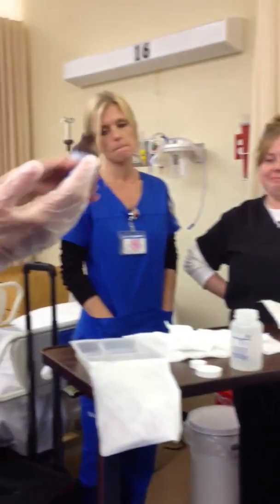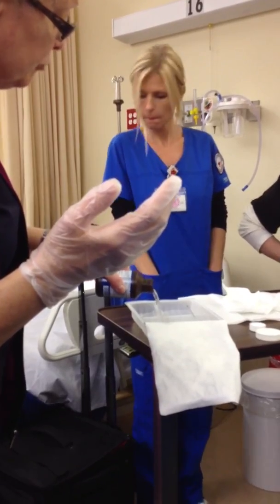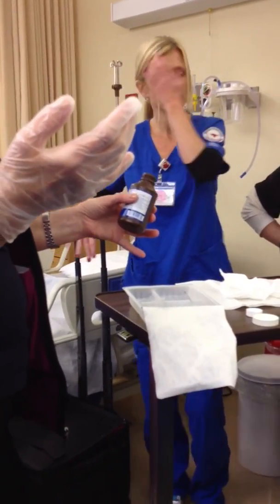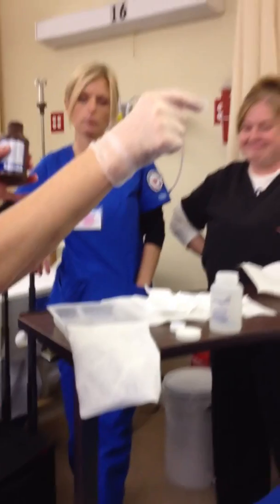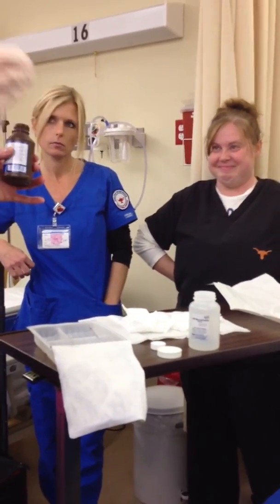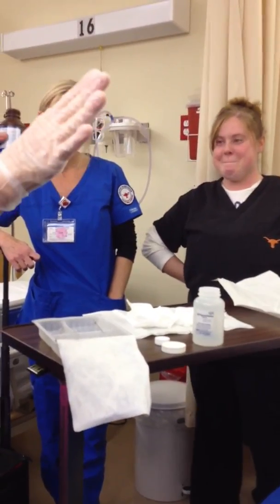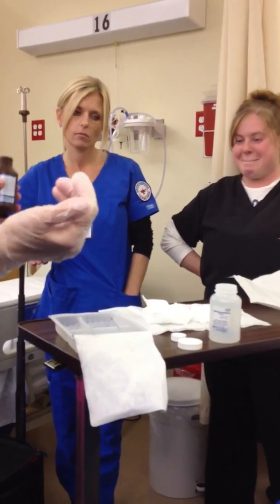Okay, so the first thing I'm going to do is fill up my hydrogen peroxide, because this is where the trach is going to go in to be cleaned. When you see these trachs in real life, a lot of times they're going to be gunky, yellow, thick, viscous, sticky, hard to get off mucus. That's what you're going to see.